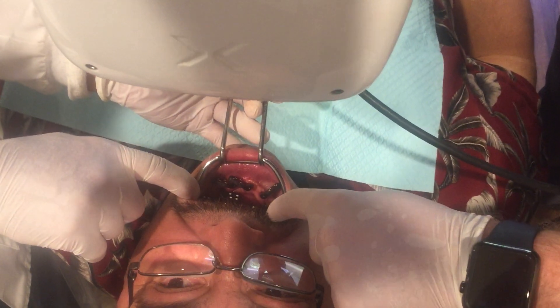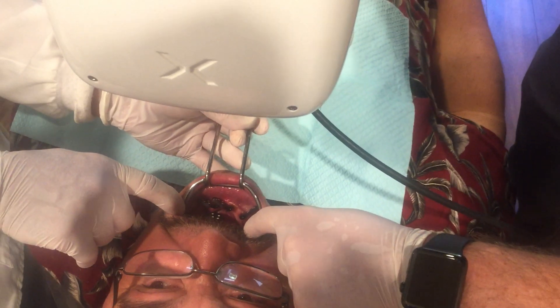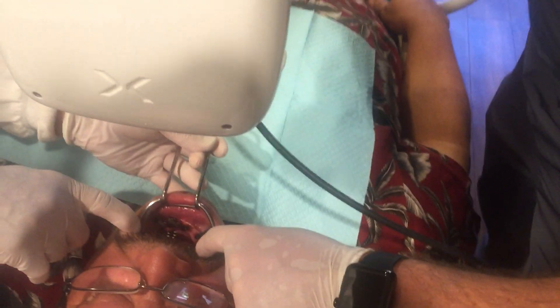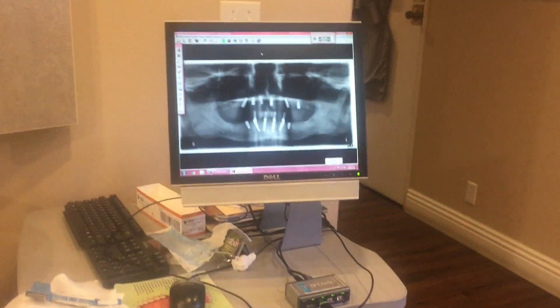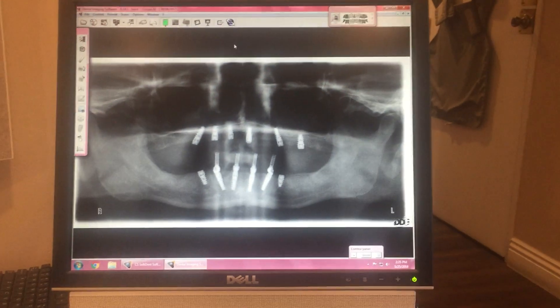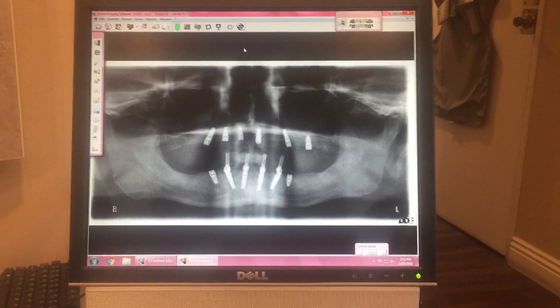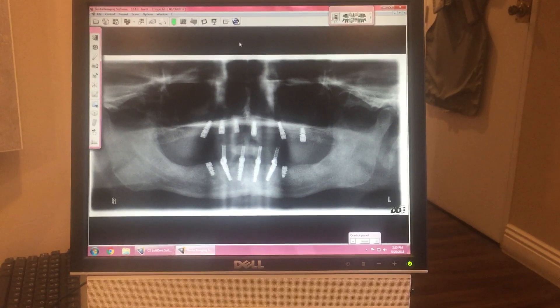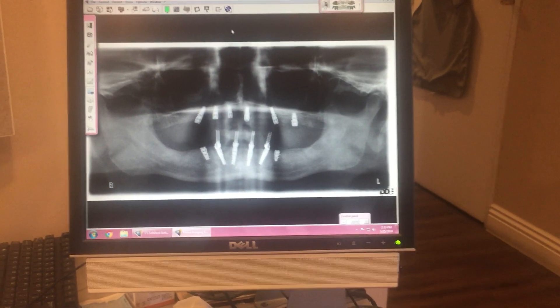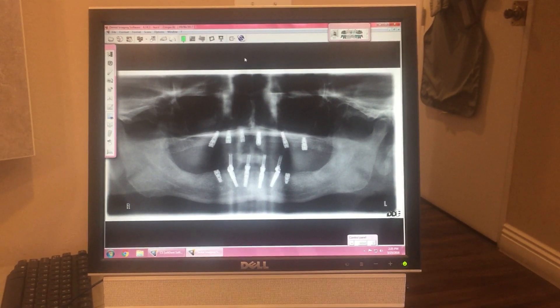There's Al's perspective right there. So the scan bodies allow us to relate the implants to each other. And if we come over here, you can see the implants that Al has had placed. Right now we're taking a scan of his lower implants for a fixed implant-supported prosthesis. This scan eliminates a lot of the variables and a lot of the inaccuracy that a traditional impression may have.